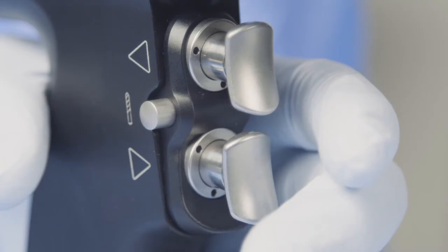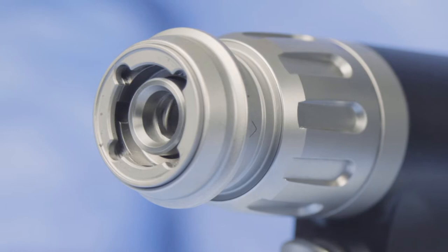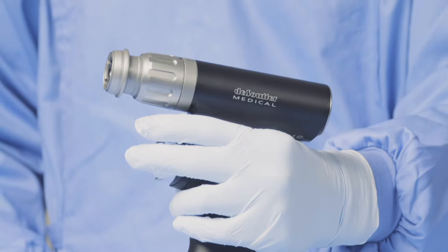If I press both triggers on this side, I get a tapping function, which makes the tool run two turns in the forward motion and one turn in the reverse motion. This is ideal for putting screws into brittle bone.